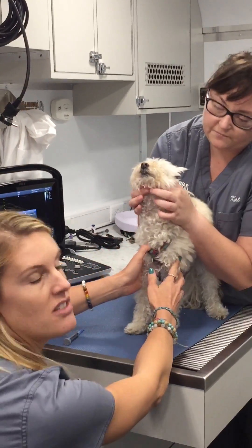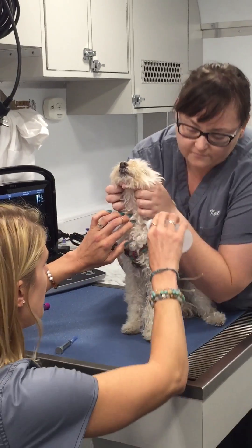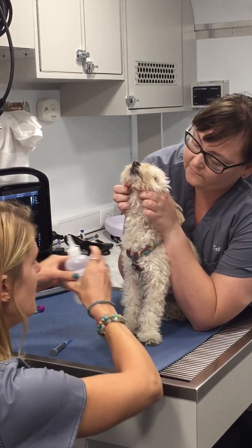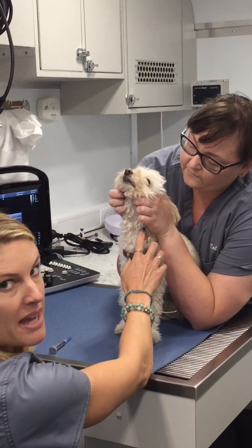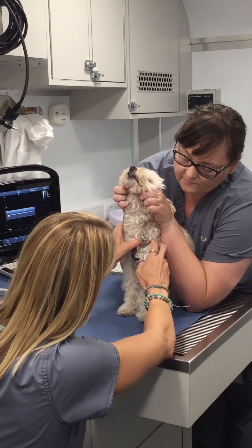So the first thing we do, Kat's just going to hold her head up slightly. We're going to put a little bit of alcohol in the area just to be clean, to make sure we're not introducing any bacteria when we do the injection. Alright, we'll see how this goes.